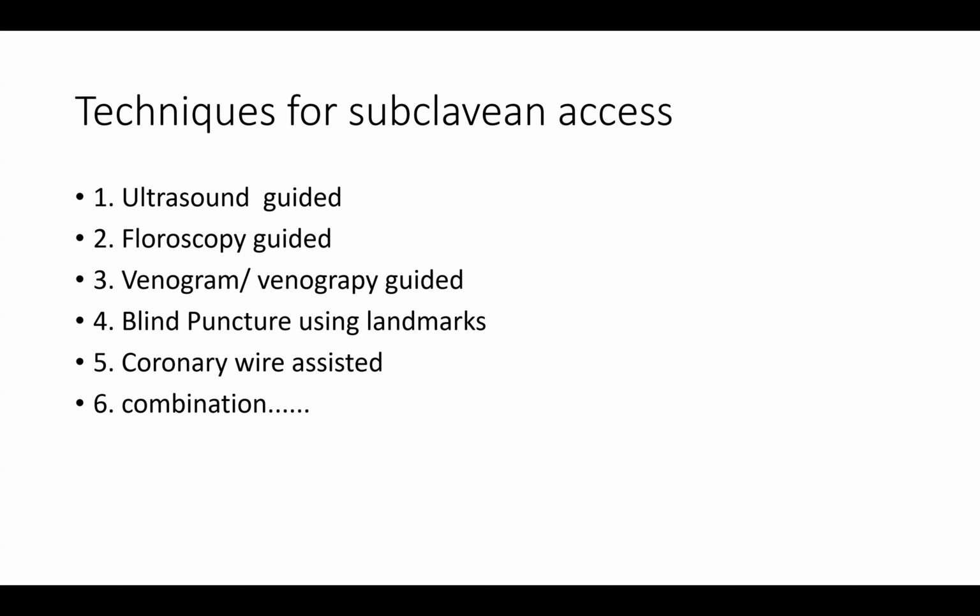We have the ultrasound guided, we have the fluoroscopy guided, we have the venography, sorry for all the mistakes in spelling here, the venogram guided, the blind puncture using landmarks, and the coronary wire assisted can also be done, or a combination of any of these can be used during the procedure.